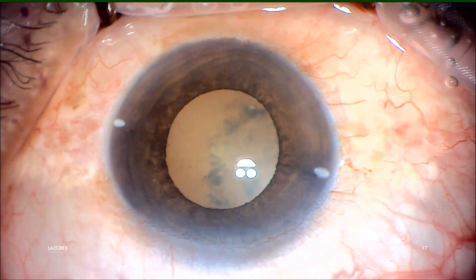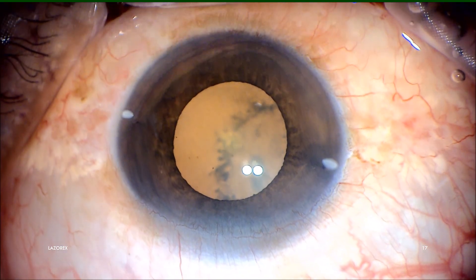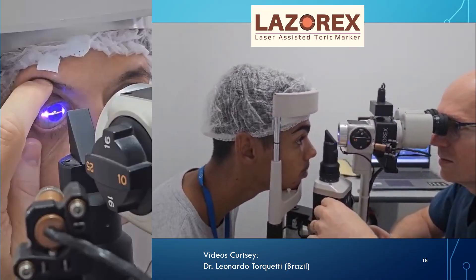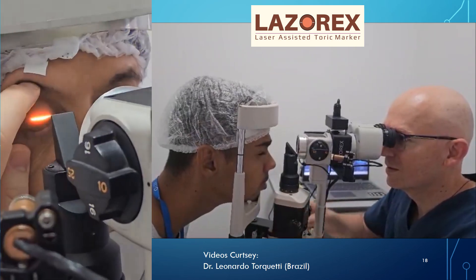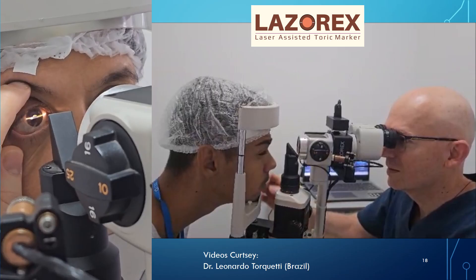Notice the clockwise cyclo rotation in the supine position. It is also a good method to do laser markings before dilating the pupil, keeping the slit horizontal and passing it through the center of the small photopic pupil. In this way, it is easier to align at the three and nine o'clock position.